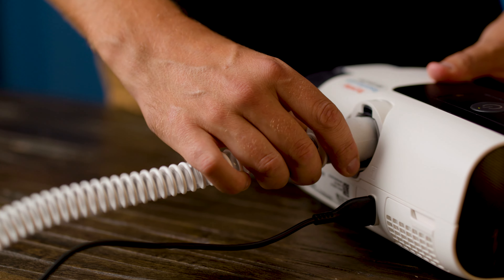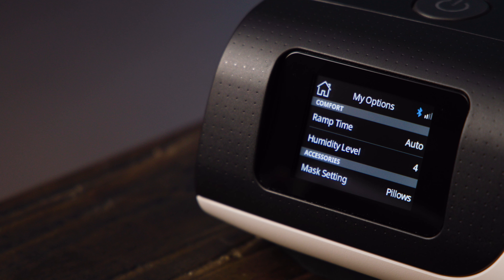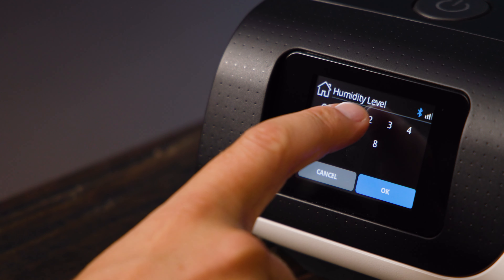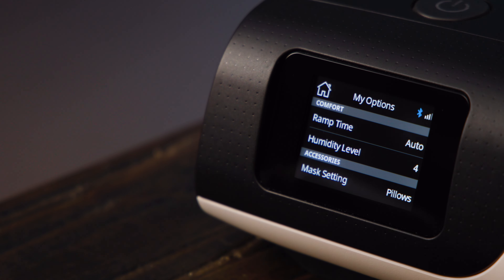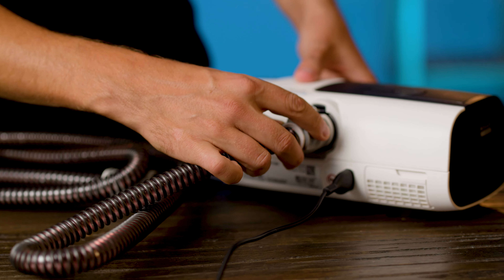What the next setting will be depends on whether you have climate line tubing or slimline tubing. If you have slimline tubing, the next setting will be humidification. This setting changes the moisture levels entering the air from the humidifier. This doesn't have an auto option, but a level of four is typically a good place to start. You can adjust this up or down based on whether you find you're getting a dry mouth through the night or breathing overly moist air. Of course, if you don't want or don't have the humidifier, you'll need to set this to off.